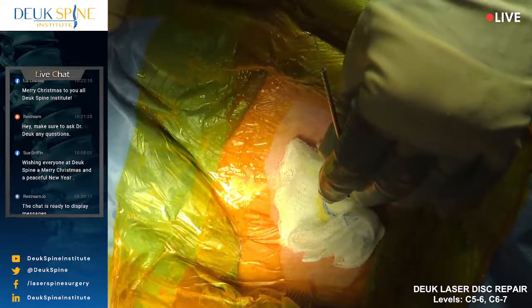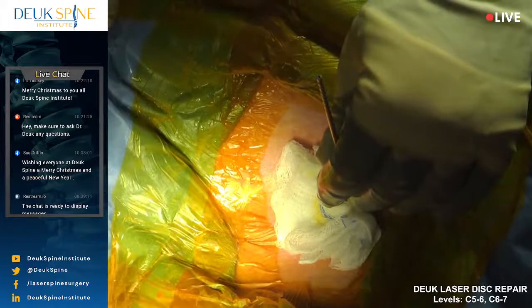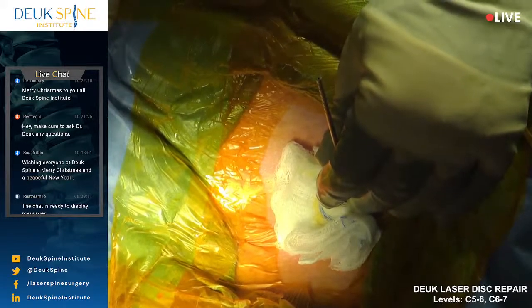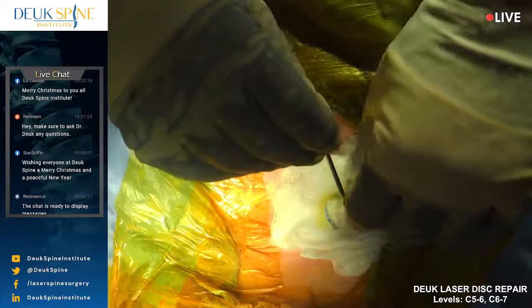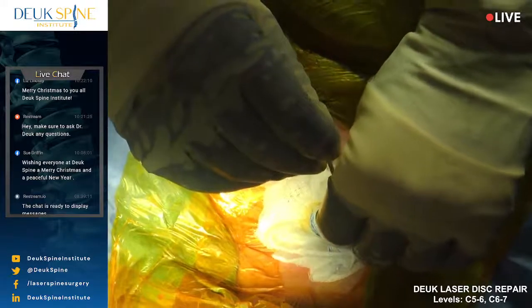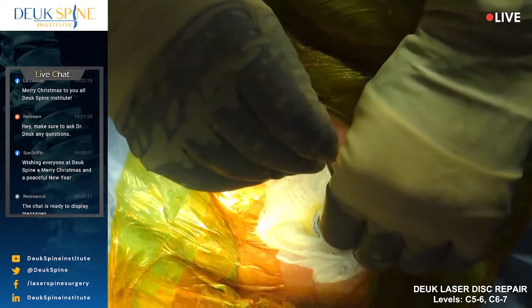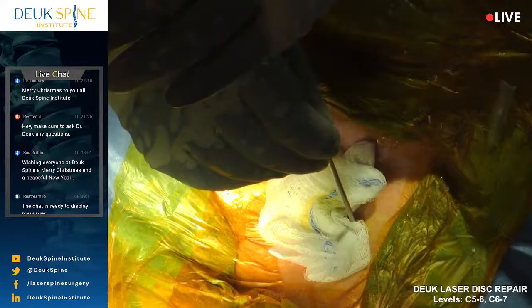Excellent. Good. So right now we're going to move from C6-7 up to C5-6. So C2, 3, 4, 5, 6, 7. Everyone agree? All right, here we go. First thing I got to do is take the dilator out of the disc space, and then I'm going to march it up the spine along the ALL. There, we're out. Shot. Good.